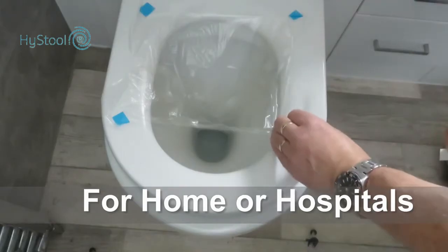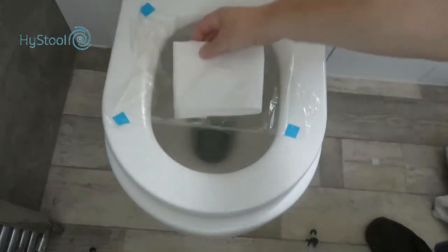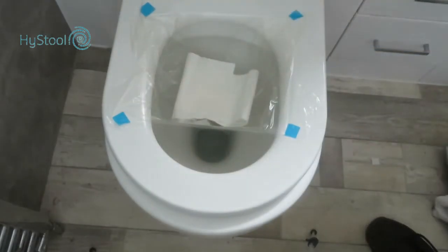HyStool could even be used by carers for elderly or partially sighted patients. Putting some toilet paper in the bottom of the bag helps prevent any moisture from reaching it while doing the test.